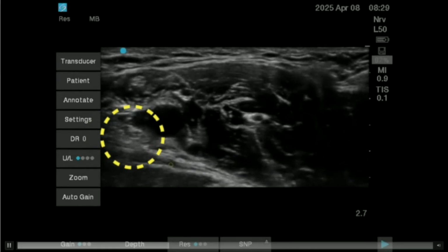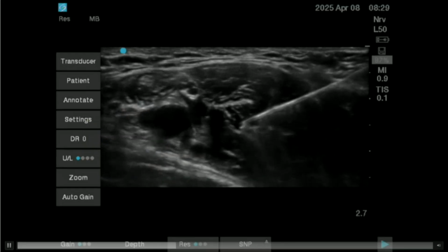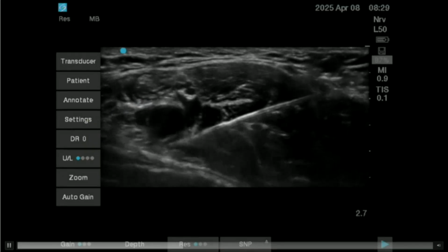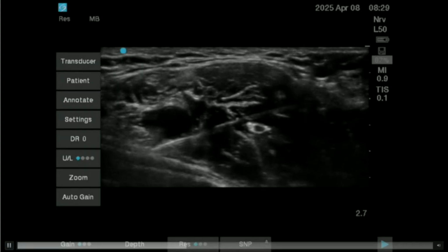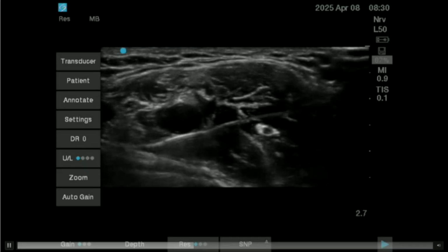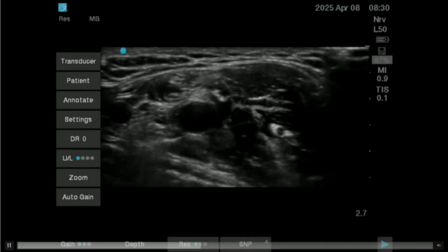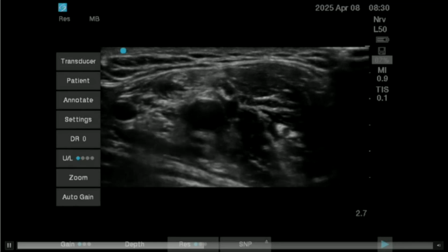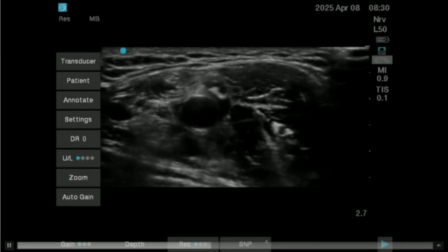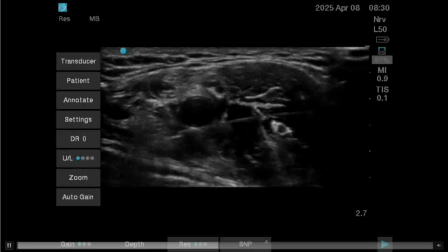And now we're going to come down to the radial nerve at the bottom. So again, a needle trajectory which is hopefully going to avoid that musculocutaneous nerve. And we're just going over the top of that vascular structure that I showed you. Again, I'm coming down onto the conjoint tendon and using the conjoint tendon to funnel the local anaesthetic to the side. I'm probably a bit deep there. So now I'm going to withdraw the needle a little bit. So I can see the local is now spreading better around the radial nerve.